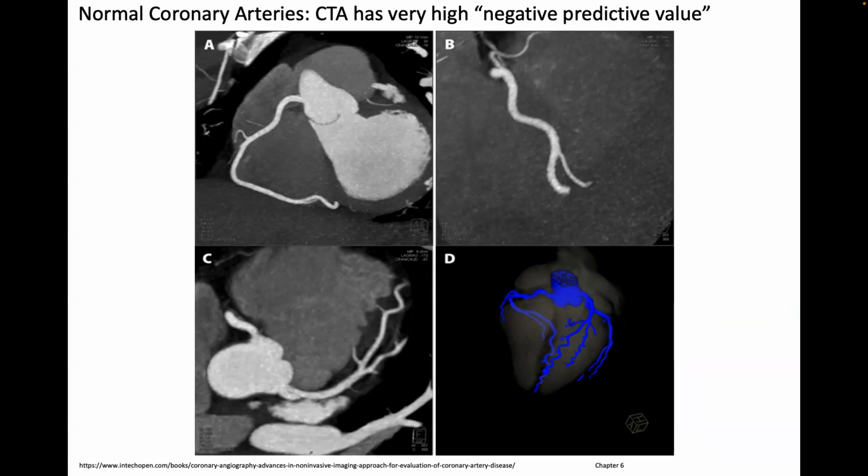The opposite side of that is, is it possible to make an image that looks like there's a lesion there when there isn't one? And yes, there is that possibility. For instance, motion might screw up your signal such that it looks like there's a lesion. However, if you get a negative call, you are super likely to be negative. It's like 99% or something.